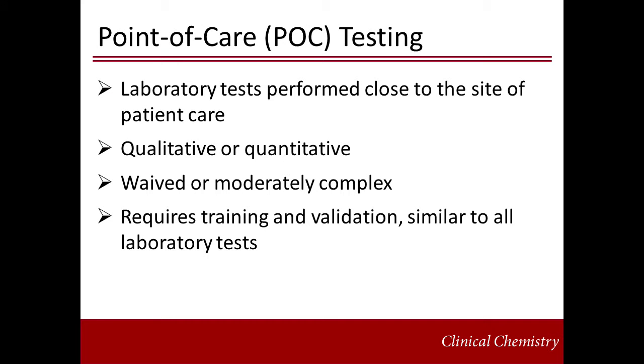By definition, POC tests are those that can be performed close to the site of patient care. This can be in a primary healthcare office, in a hospital, as self-monitoring, at a health fair, or in a third world country. POC tests are designed to either give a plus or minus qualitative result, or, in other cases, a precise numerical measurement.